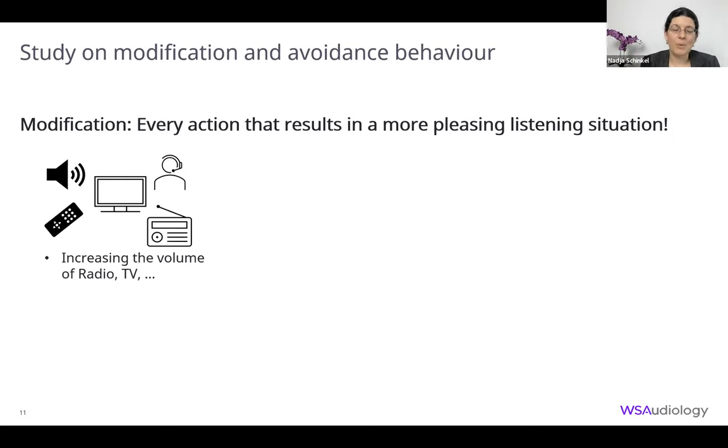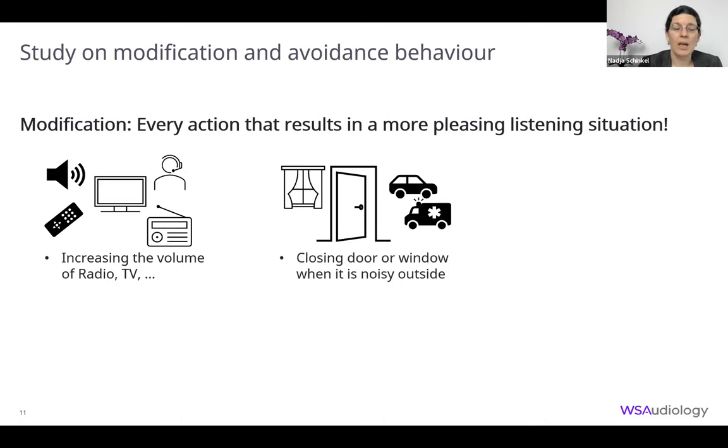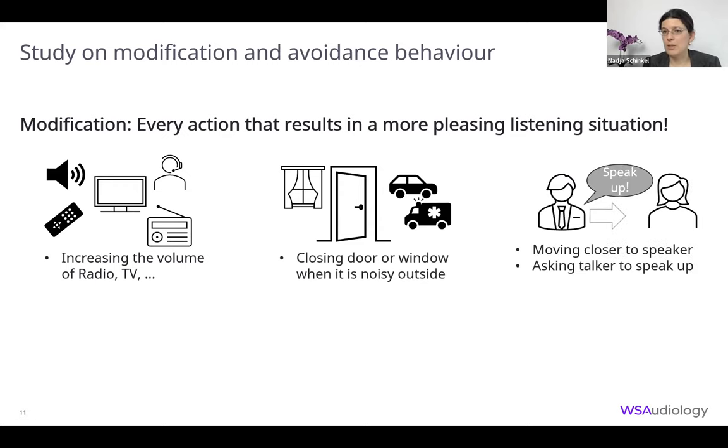So no problem. Second study, we really wanted to look at what modifications people make in their everyday life. And so what are modifications? It's basically every action that results in a more pleasing listening situation. It could be that you increase the volume of the TV or the radio so you understand it better. It could be, if it's noisy outside, that you close the door or the window. Or, if you're in a conversation, that you ask your conversation partner to speak up. Or you go closer to your conversation partner to increase the SNR.